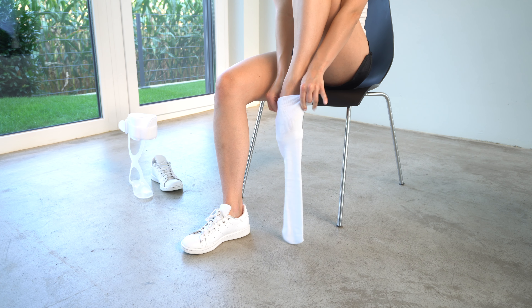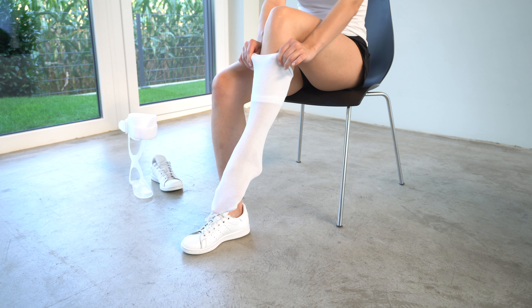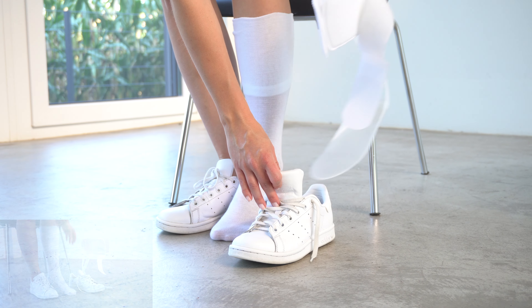The orthosis shouldn't be worn directly on the skin. Therefore, pull a stocking over your foot.